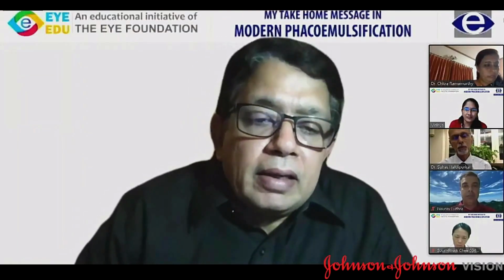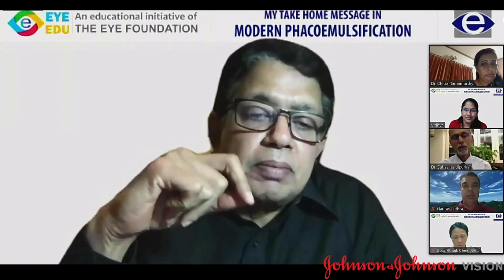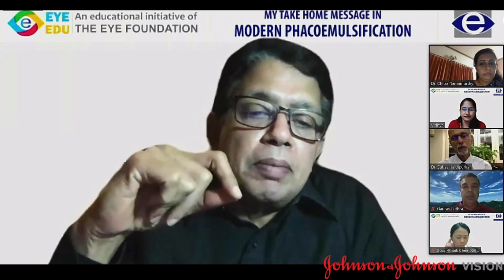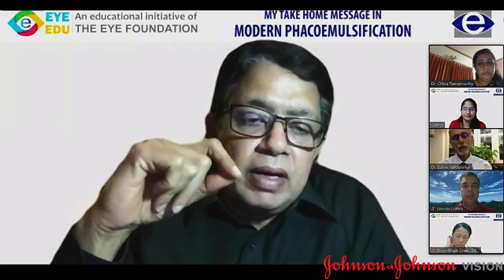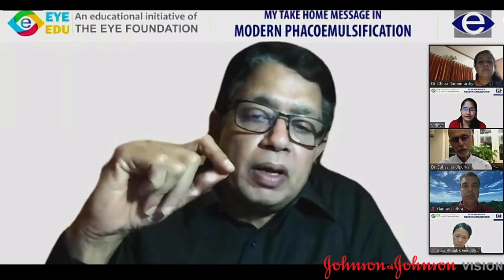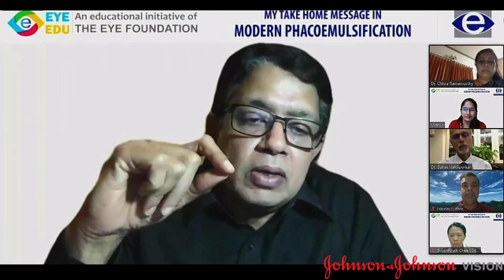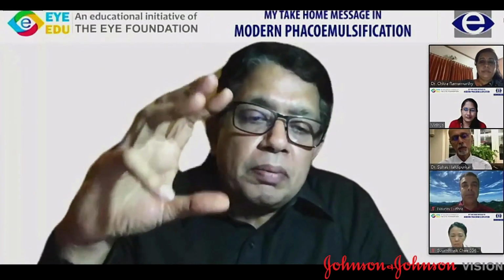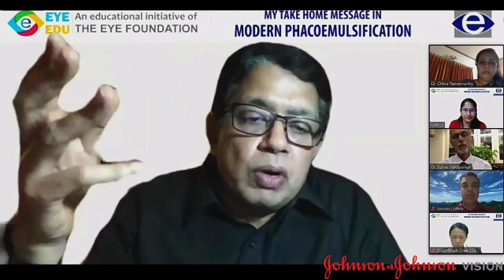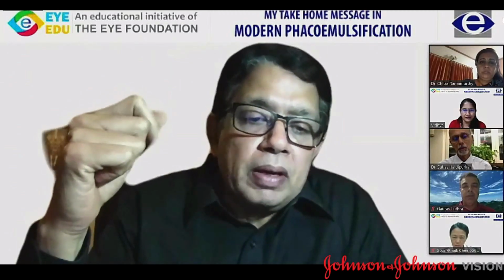Thank you. I can't agree more with you, Suhas. I think we are fortunate in the sense custom-made lenses of even plus 60 diopters can be made. One thing is the amount of spherical aberration that these lenses have is very extreme. And calculation of the IOL power in these cases, whatever formula you use, is never accurate. So debulking the majority of the power with a plus 40 diopter good lens which is available, then subsequently using the simple formula of into 1.5 for the residual hyperopia truly works.